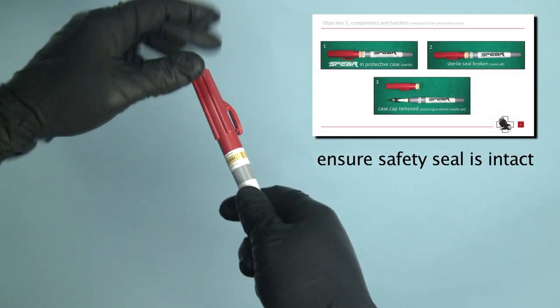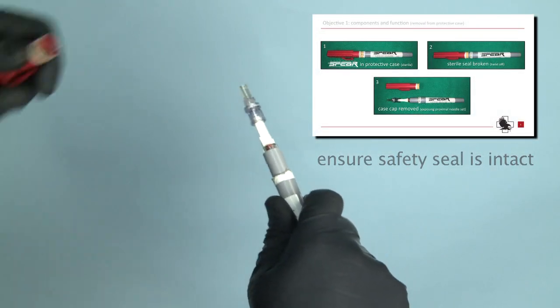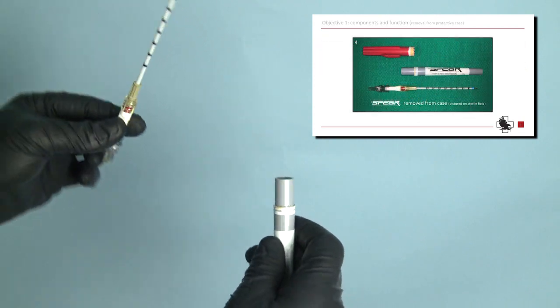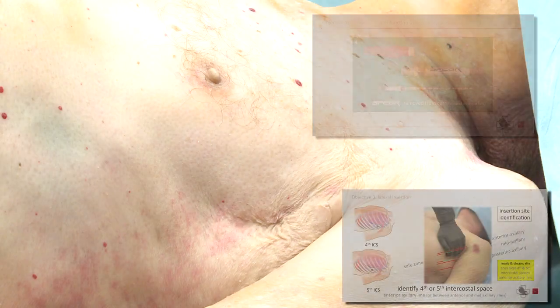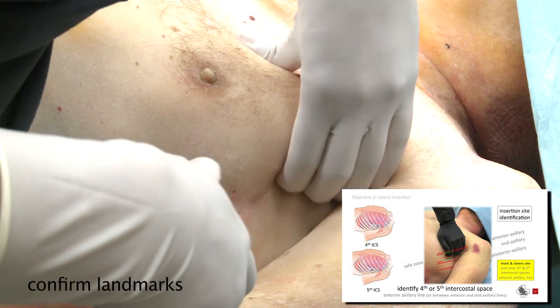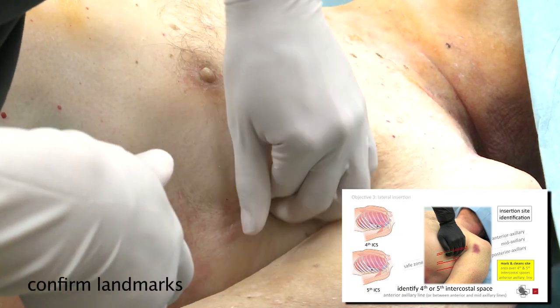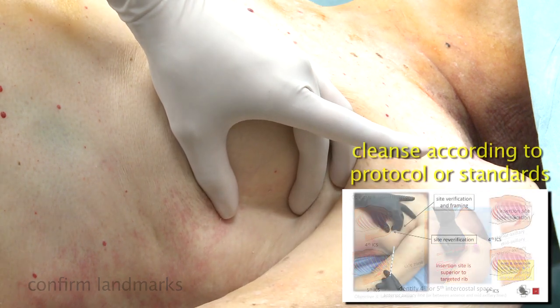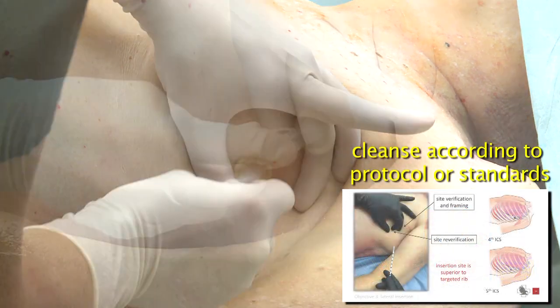Grasp case and ensure safety seal. Twist off cap and remove SPEAR. Confirm landmarks. 4th or 5th intercostal space, anterior axillary line. Cleanse according to protocol or standards.